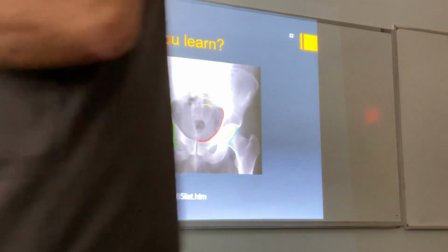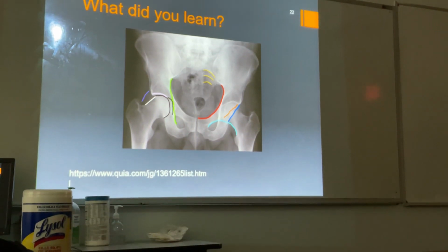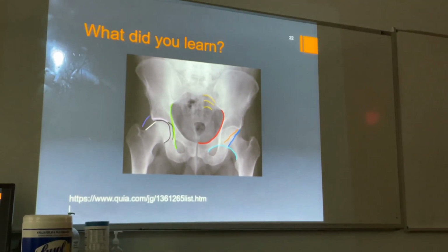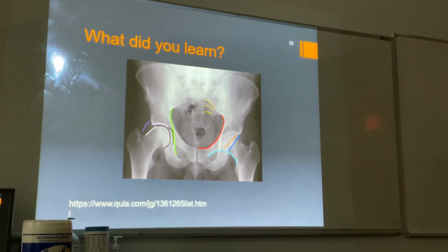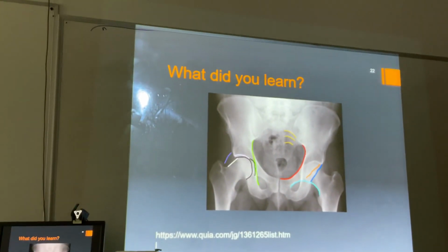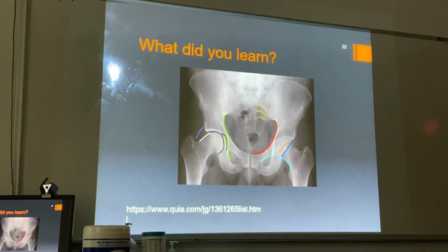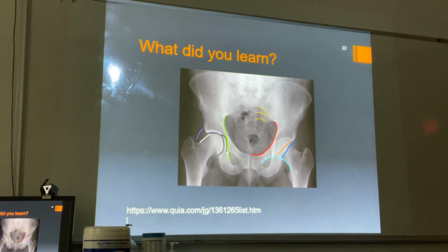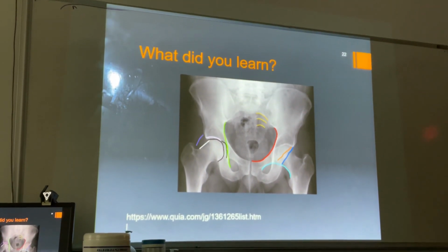I forget, it's getting mixed up, but we saw a sacrococcygeal dislocation about 2 weeks ago. I'm trying to remember who was reading with me, but we saw it, okay? So it's more than just lumbar spine, it's the sacrum/coccygeal region, all right? And you know my argument, if you've had back pain for 4 to 6 weeks, get the previous x-rays. If they're great, you can use them. If they're shitty, pardon the pun, you make sure you evacuate the bowel, okay?